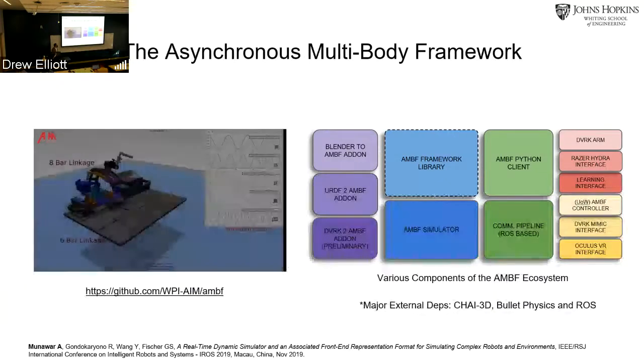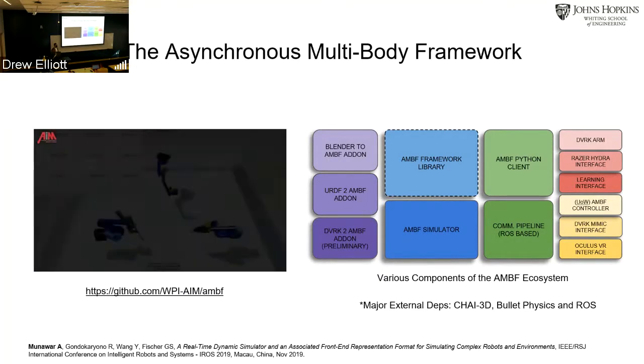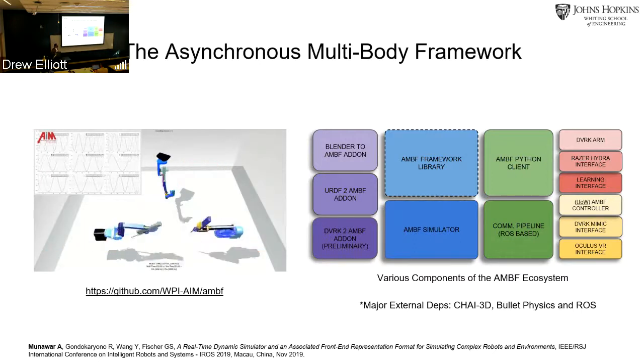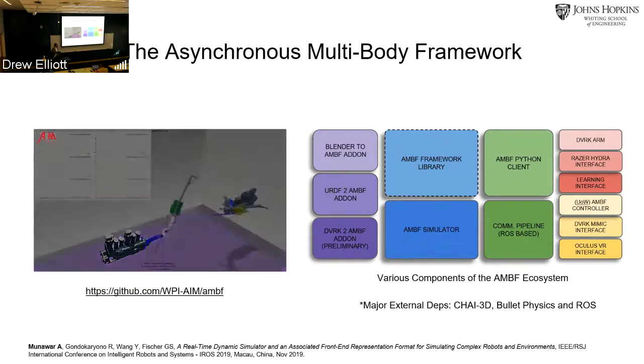After years of trying to simulate the Da Vinci surgical robots and writing plugins that were deprecated with evolving APIs, the idea of a novel simulation framework was conceived, and AMBF is just a realization of that idea. AMBF is robust, and it involves a lot of individual components that together streamline and simplify surgical robot simulation.